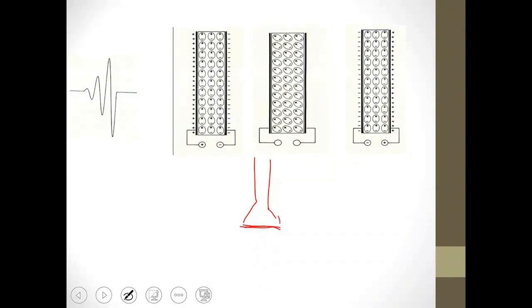Here there is a part called the probe surface. The probe surface consists of elements or crystals. We took a material from them and said we would bring a material with piezoelectric properties. What are these piezoelectric properties? The material starts to do something called heating, and this heating continues until it reaches a certain temperature called the Curie temperature.